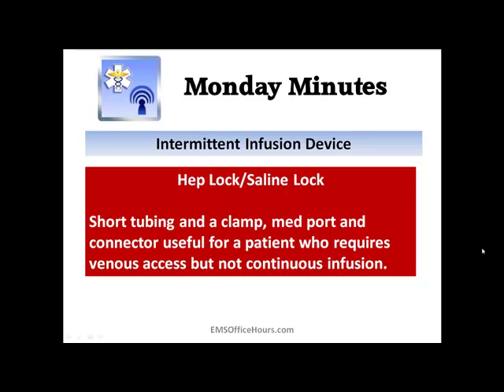Okay, so you start the IV. You've got the med port. You're going to flush it with saline or heparin. Okay, and then a connector which goes right into the hub of where you start the IV.